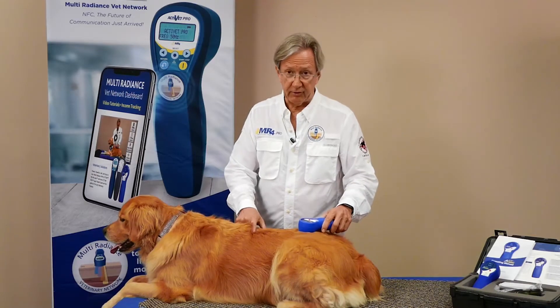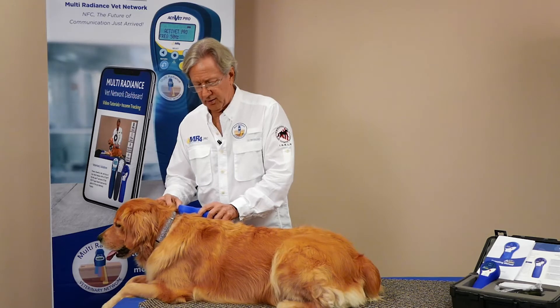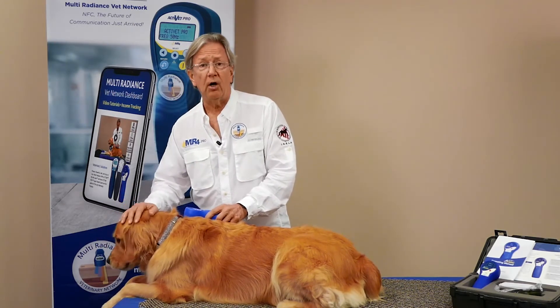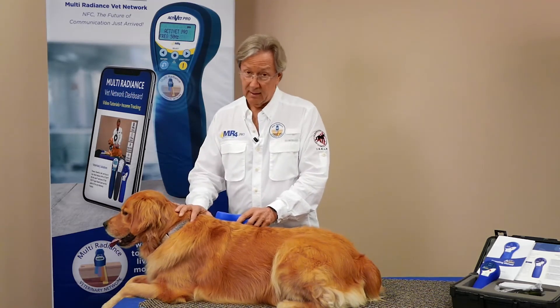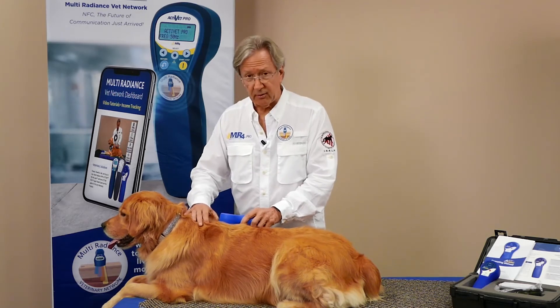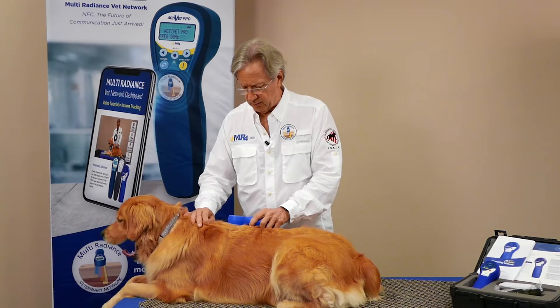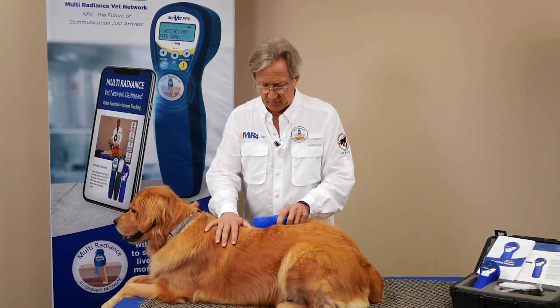When we get to the bottom at her tail we'll come back up and do the same thing down the other side. As you can see it's super easy to use at home — your dog is nice and calm, no anxiety. Having to go to the vet for a series of treatments is stress-producing, and if we can eliminate that stress but still get the most effective laser therapy treatment into those painful areas, we're improving outcomes — and as a vet, of course, that's what you love.